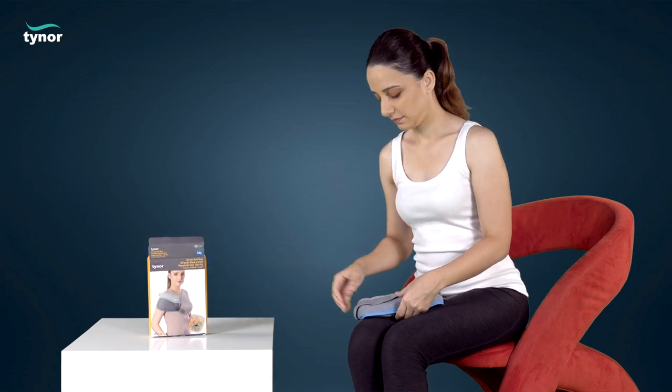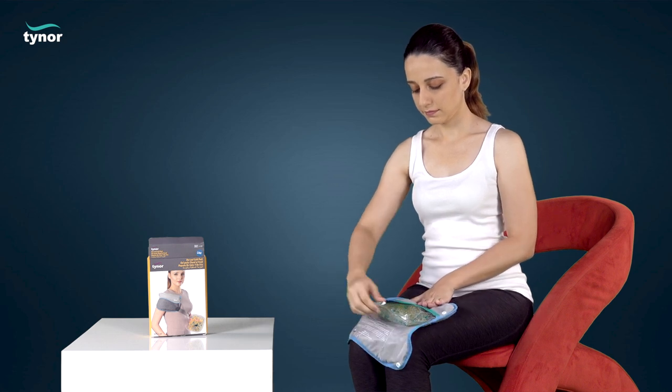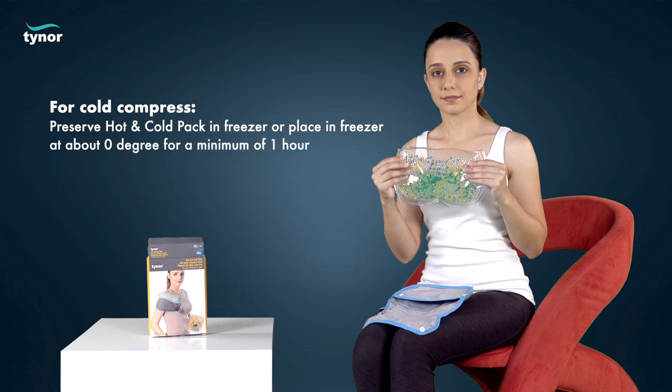Remove the hot and cold pack from its pouch to make it cool or hot. For cold compress, preserve the hot and cold pack in the freezer, or place it in the freezer at about zero degrees for a minimum of one hour.